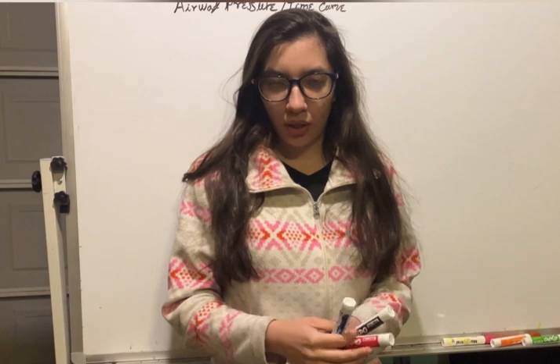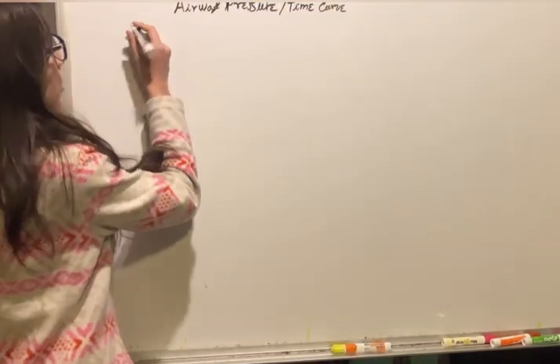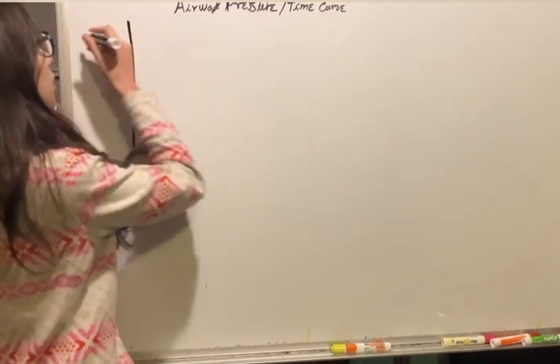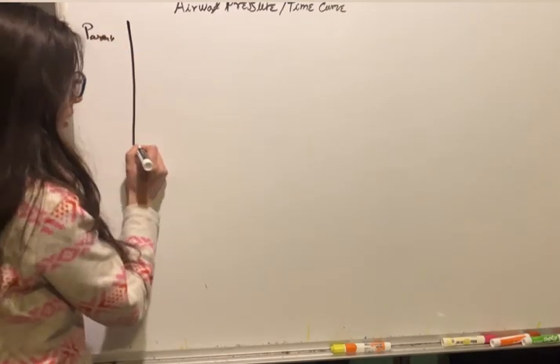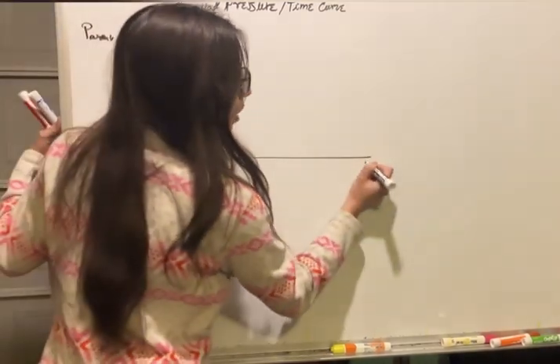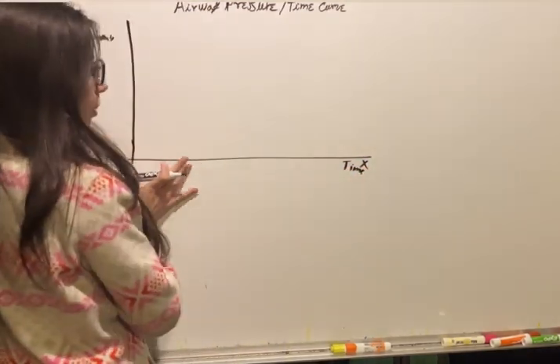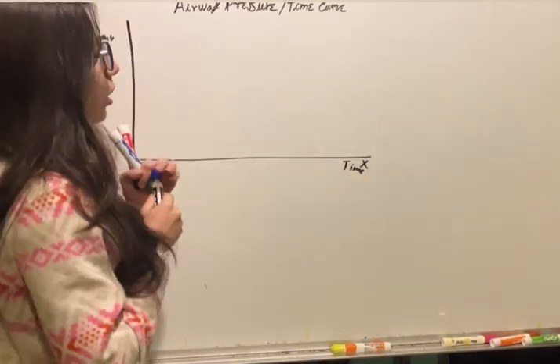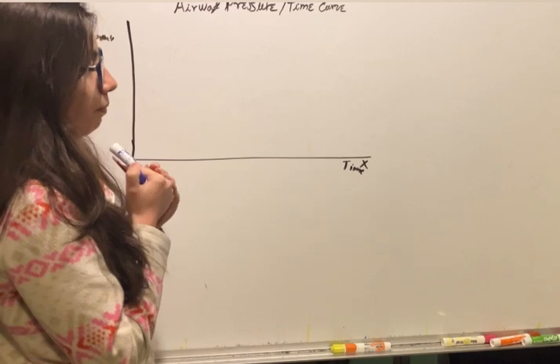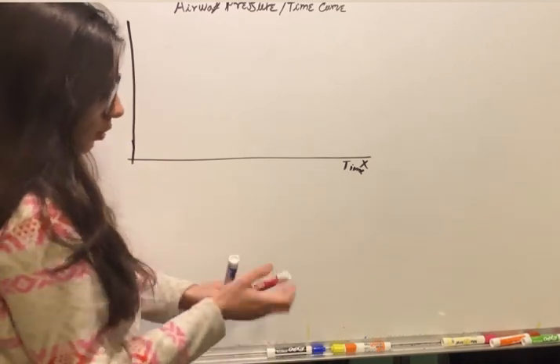Now let's see the airway pressure time curve during mechanical ventilation. Here we have on the y-axis the pressure of the airway, and on the x-axis we have time. So we have inspiration, expiration, inspiration, expiration. And we have 5 important pressures we're going to review.